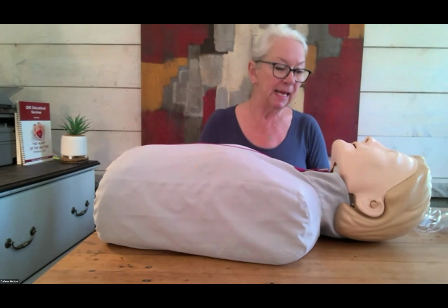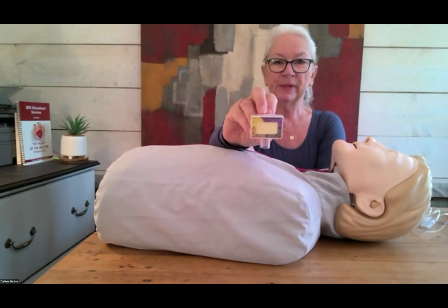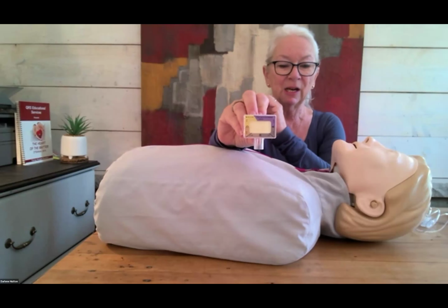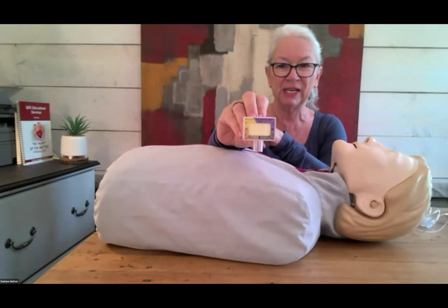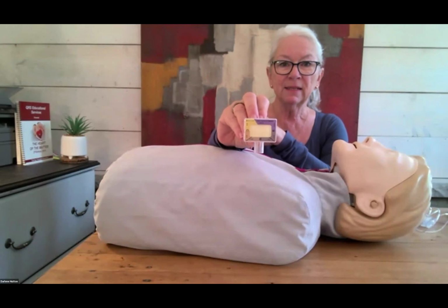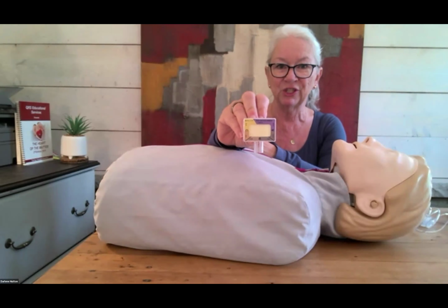Next is the end-tidal CO2. Most of you in the smaller hospitals don't have your crash carts equipped with continuous waveform capnography on all of your machines. So this colorimetric device helps us to determine that we are in the right location.